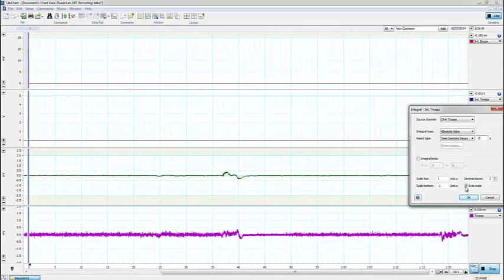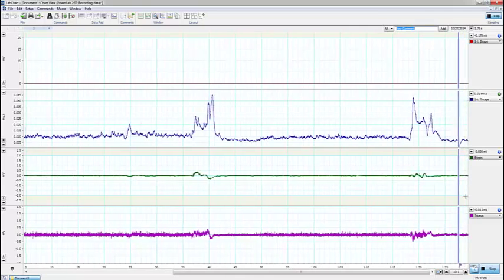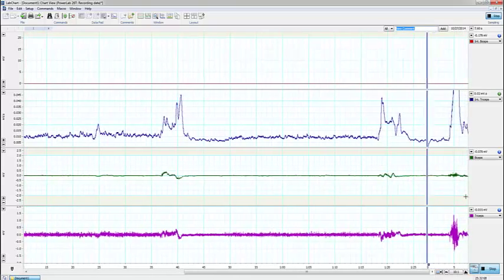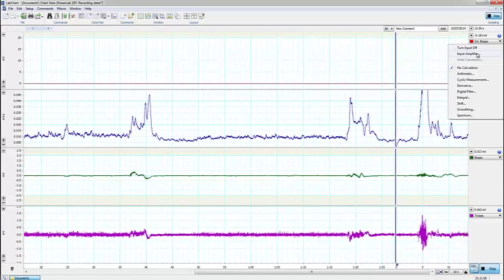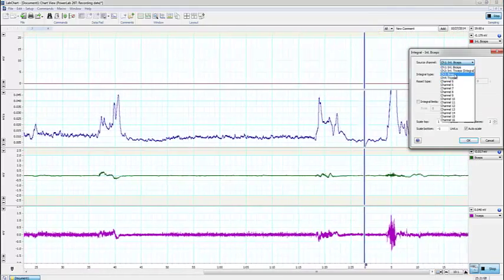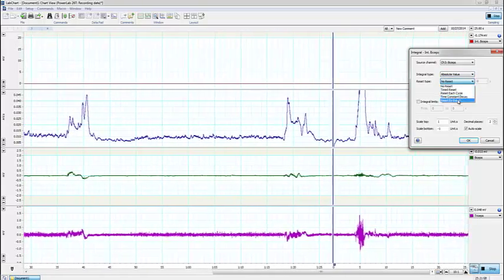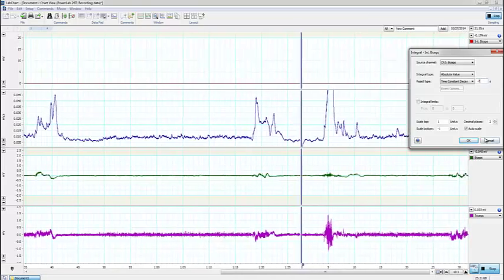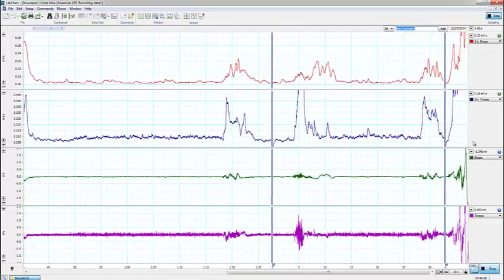I put in 0.2 seconds for the time constant decay, and I make sure that auto scale is checked. Now we can see it's getting some kind of a feed — I'll contract my triceps and we can see activity. Now I'm going to set up the biceps: turn the input on, take the raw bicep signal, choose absolute value, choose time constant decay, put in 0.2 seconds, click OK. Auto scale was checked as well, and now I see biceps activity.